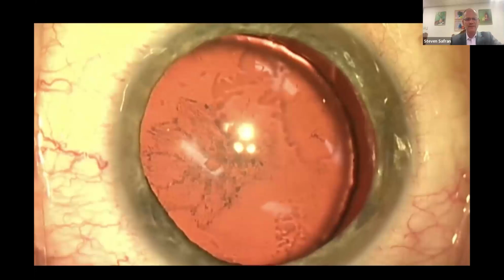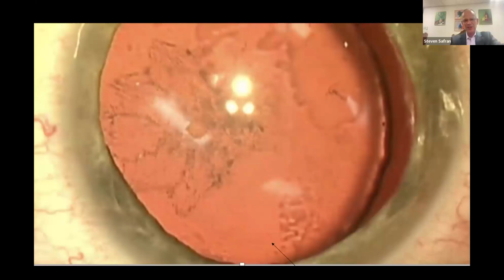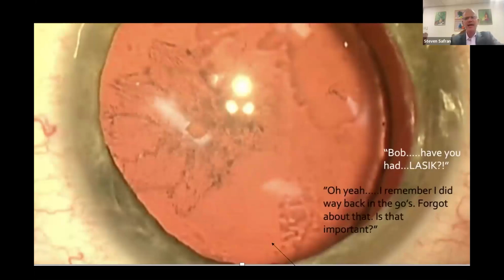So he comes in from California. We put him under anesthesia, block him. I get him in front of the microscope, and I see this. And what's that? Bob, have you had LASIK? Oh yeah, I remember I did way back in the 90s. Forgot about that. Is that important?